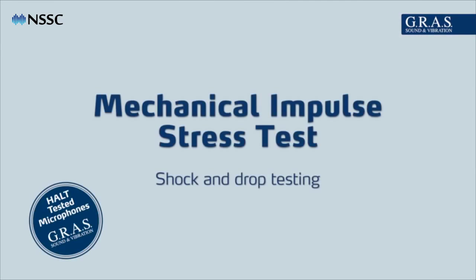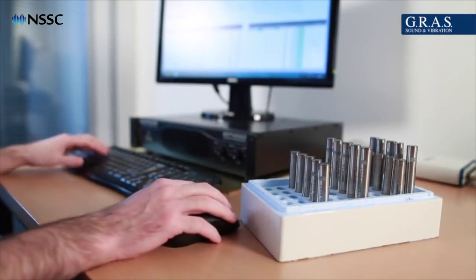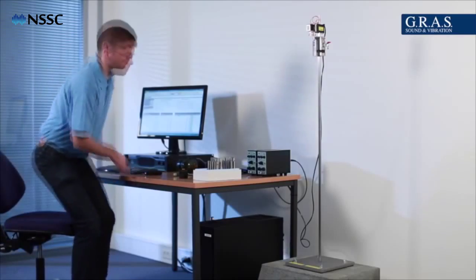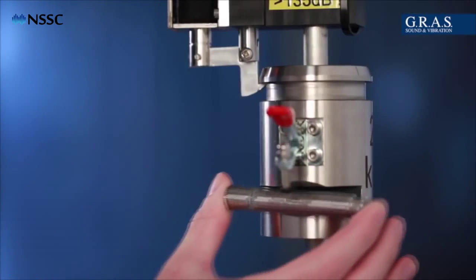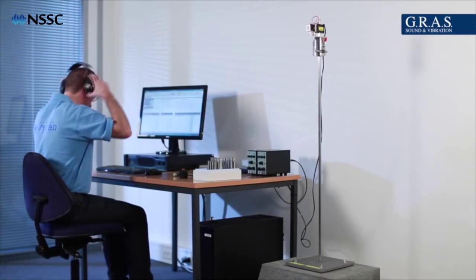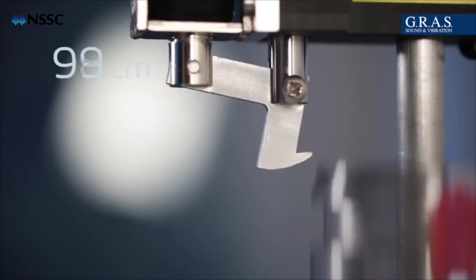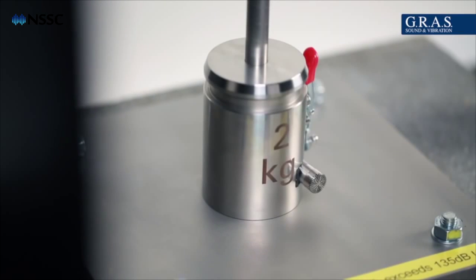Finally, our mechanical impulse stress test simulates the conditions a microphone can be subjected to in demanding test environments and due to unintended use. When shock testing the microphone, we mount one horizontally on a 2 kilogram weight and release it from a height of 1 meter. This shock test accelerates the microphone to more than 100,000 Gs when it hits the solid structure.